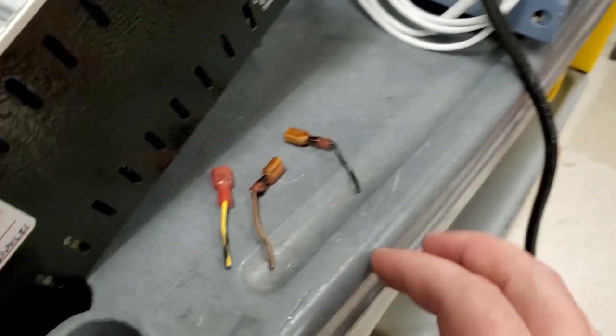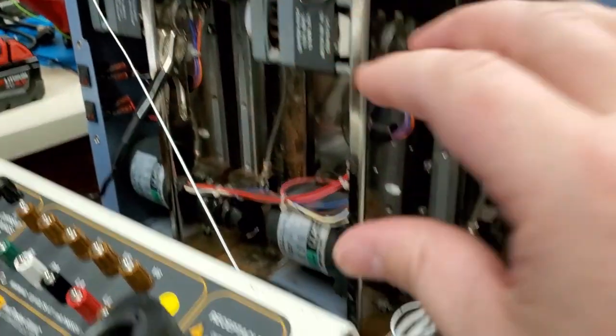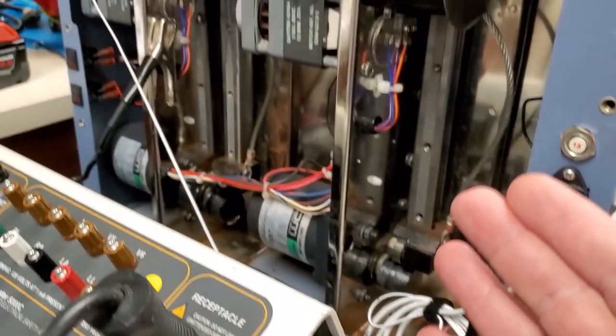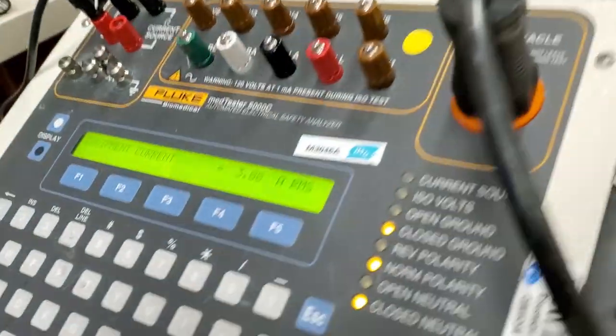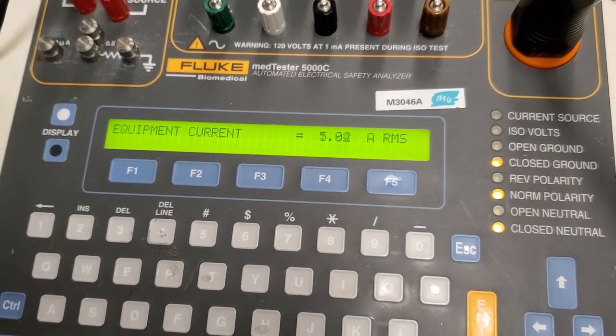What caused that? This is caused by overcurrent — either overcurrent because of faulty components, or overcurrent because of too thin a conductor. Hard to say, but we can test that, and we test it with our electrical safety analyzer. It's one of the easiest ways to do it.